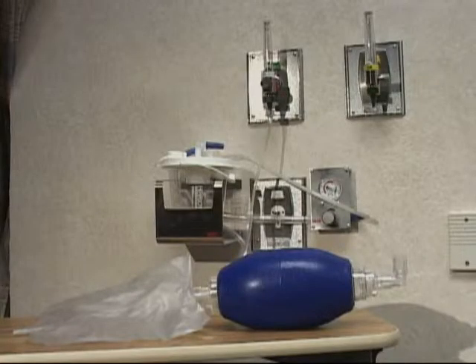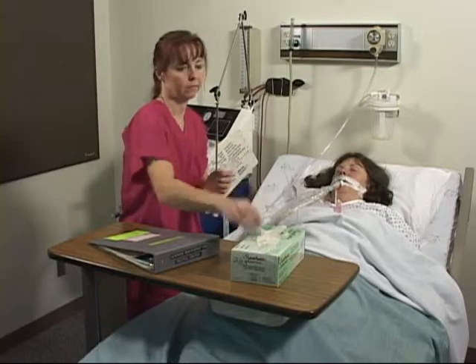If using the manual resuscitation bag connected to an oxygen source, squeeze the bag every 5 seconds for 30 seconds to hyperinflate the alveoli and increase their oxygen stores temporarily. Put on personal protective equipment as appropriate. The catheter should be no more than 1/2 of the diameter of the tube.